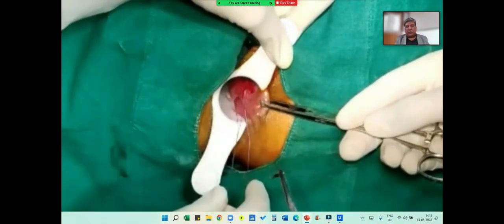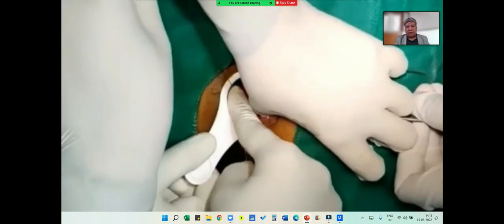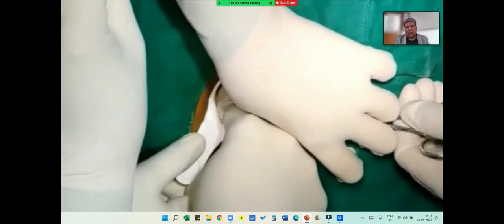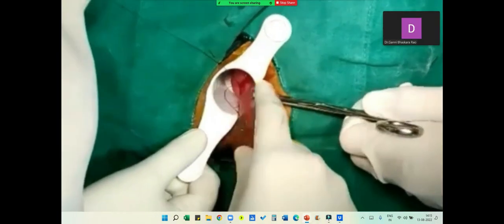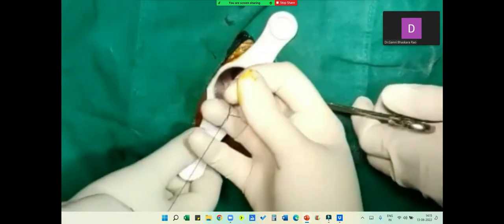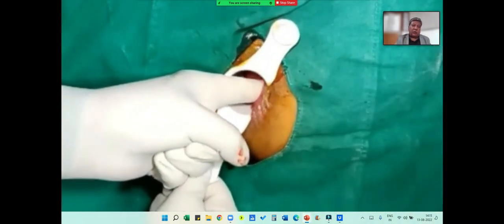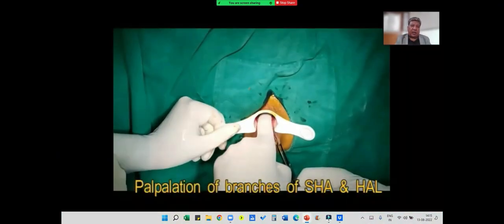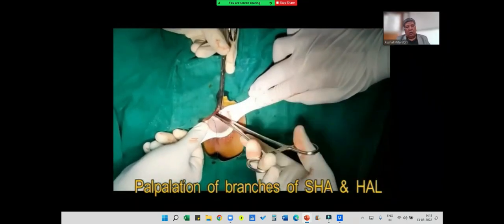So the suture is coming out. The thumb of your assistant is pressing on the hemorrhoid, and then you tie it. After the first knot, they can let go. And then you tie subsequently, and you do this all around. Feel for the hemorrhoidal artery and do it all around. Suppose you felt the hemorrhoidal artery, you've done it, and you feel again, and you can still feel it, then you can go a little higher up and do it again. And then you keep doing it circumferentially all around. So usually 4 to 6 are going to be palpated.